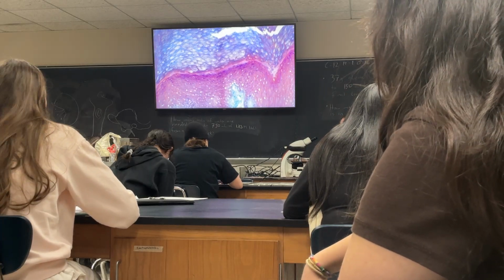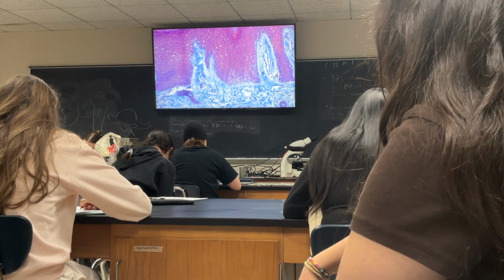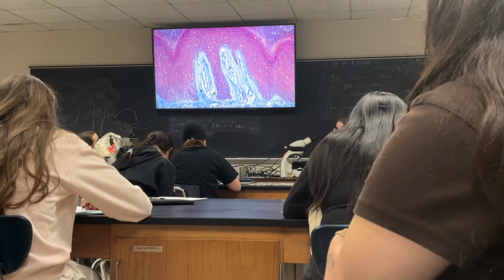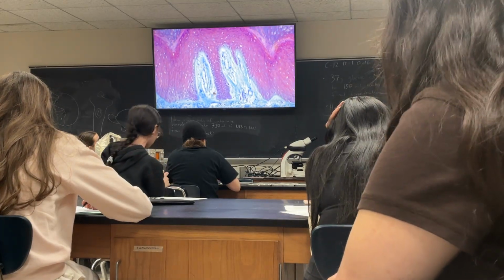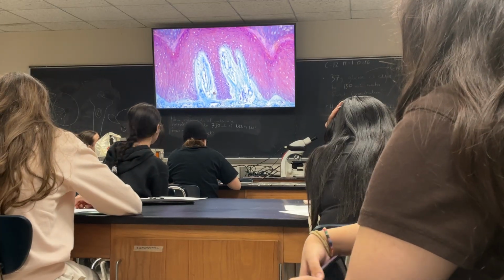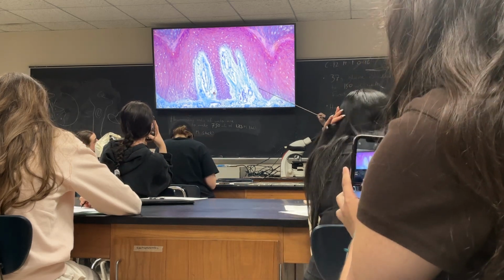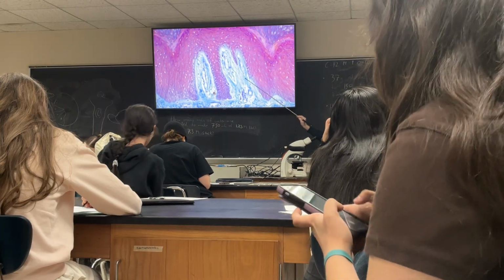So what do we expect to be right underneath any epithelium? Basement membrane, I can't see the basement membrane. What tissue do I see underneath epithelium? So the golden rule is anywhere I have epithelium, the next layer is probably going to be areolar connective tissue. Because this is somewhere towards the top of page 12 with me. So here's the line between the epithelium and the connective tissue. And here, this is all areolar connective tissue.